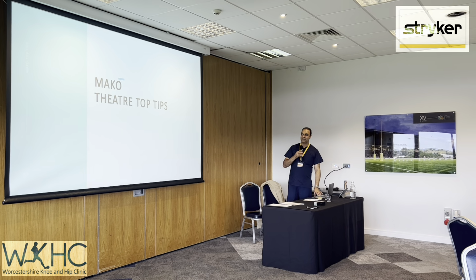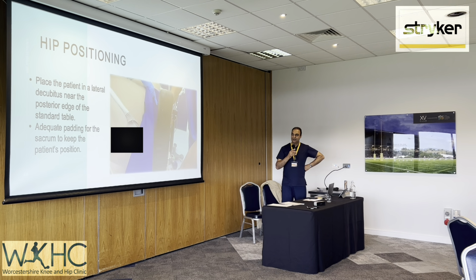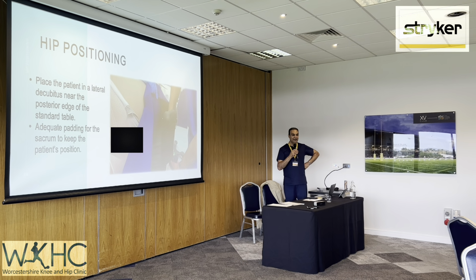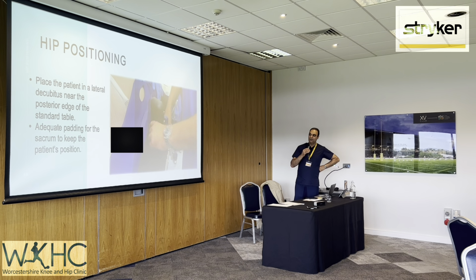Right, let's make some tips. What tips can we give patients? So first of all, it all starts with positioning the patient. When you position the patient, you've got to make sure that the props are low profile.